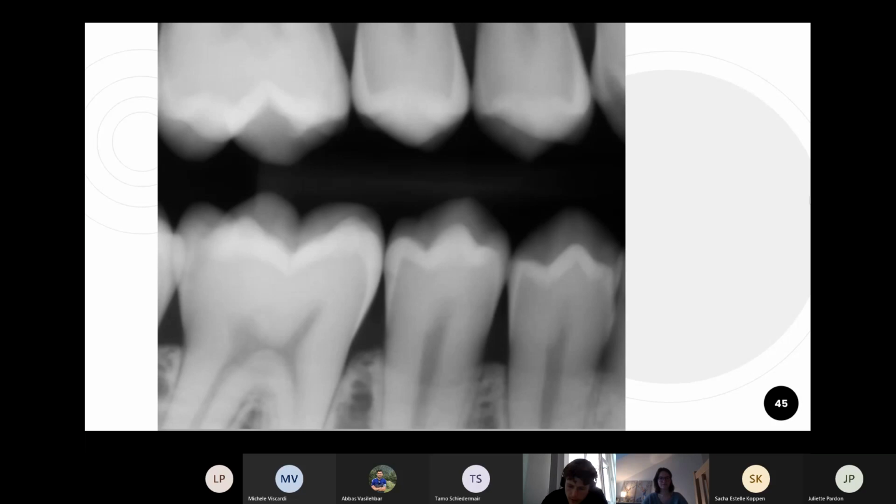Yeah, so same story, right, a bite wing of the first and fourth quadrant, the posterior teeth. And there's one lesion in this, it's really hard to see it. I basically just put this picture in to demonstrate how subtle it can be sometimes, especially if the X-ray quality is not great like this one. It's kind of blurry, everything. And you can see on 4.5 distally, you can see like a little conical.